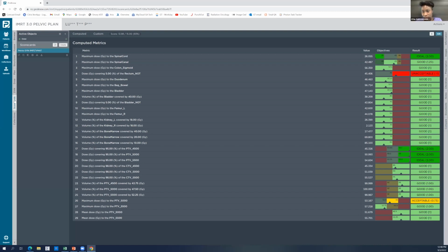I think Jasper is also asking about the method that has been discussed for how to manage the max and min dose for OAR overlap with PTV. In the case of a volume dose constraint, that is not more than 30% of the bladder should receive 45 gray, what will be the best way to manage this? I want to believe that was what you talked about, creating an optimization structure by subtracting the overlap, but I will let you answer that question.